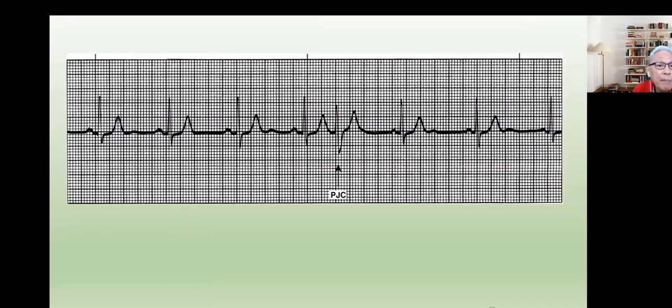Here's another example. Notice now that we have a regular rhythm, and all of a sudden there is a beat that comes before. So we call this premature. Premature what? Where did it come from? We notice that this does not have any P wave. This is coming from the AV node. So therefore, we call that a premature junctional contraction.